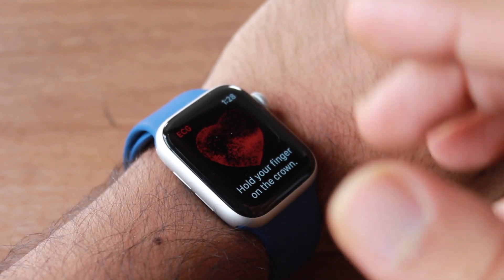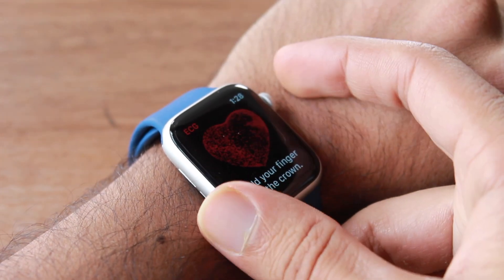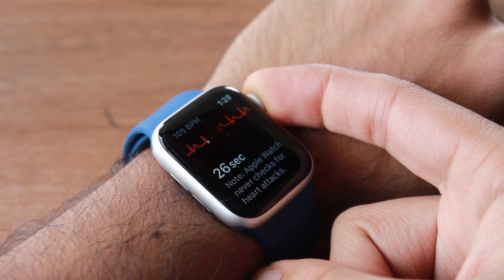After setting it up, it will look like this. You have to hold your finger on the Digital Crown, and it will measure for around 30 seconds.